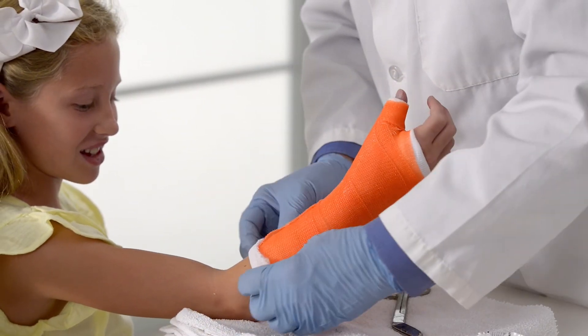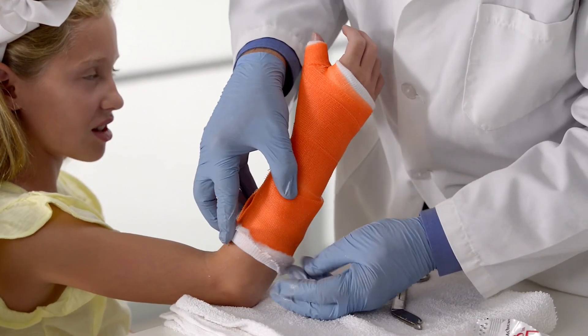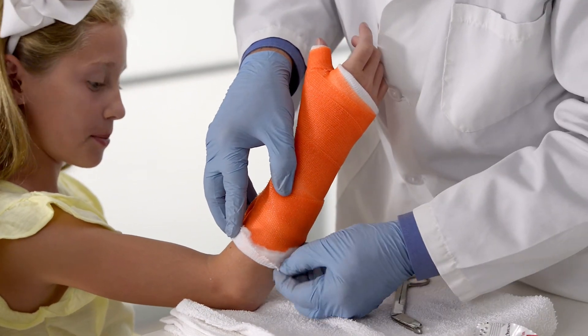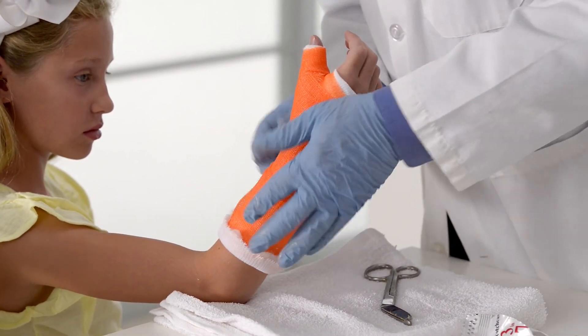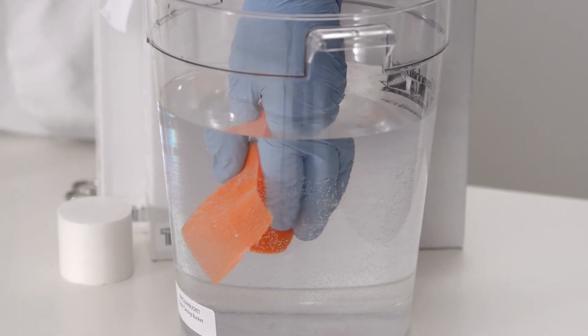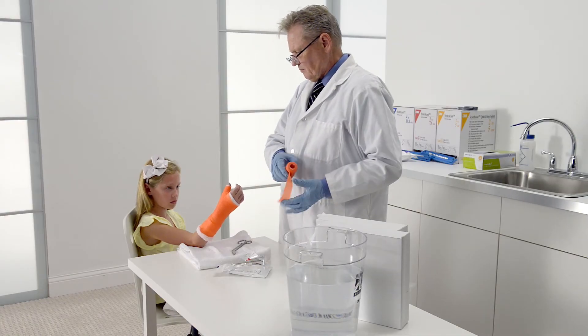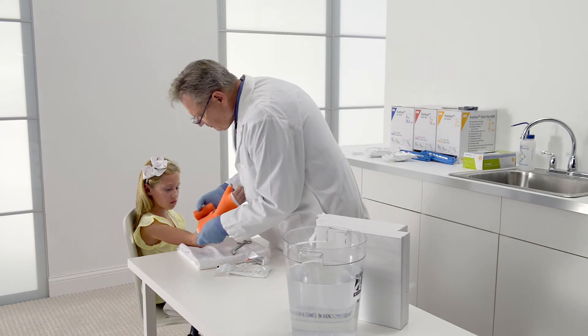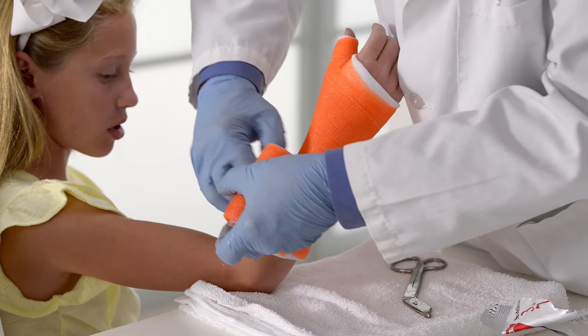At the proximal end of the cast, fold the stockinette back over the padding. Assure 2 finger widths below the forearm crease are present for proper cast placement and to not restrict patient movement. For the second layer of the cast, start by dipping the roll in water. Do not squeeze the roll if the maximum set time of 5 minutes is desired. For faster set time of 3 minutes, squeeze the roll 3 times.